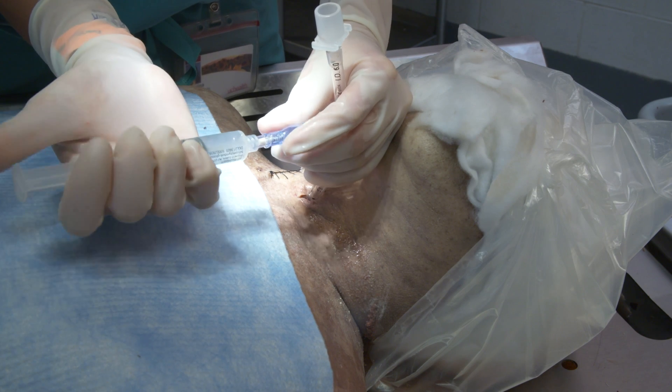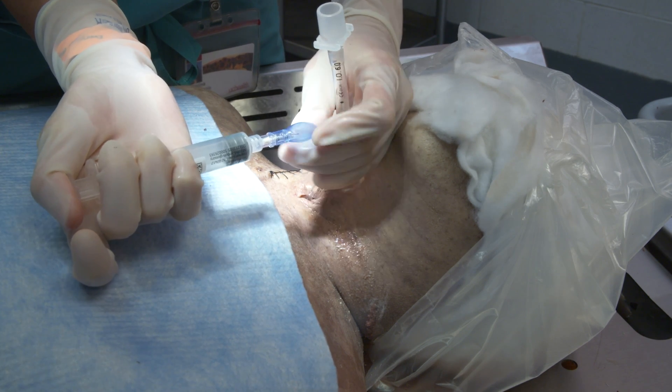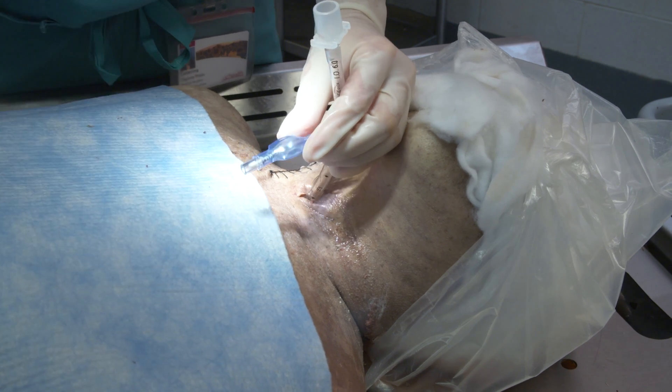Check for proper location by CO2 detection methods, lung auscultation, or bronchoscopy. Secure the tube at the skin entry site with sutures or tape — it is critical that the tube is not dislodged. Once endotracheal placement is confirmed, be sure the patient is sedated, has pain relief, and is restrained, and thus unable to self-extubate. When able, you should also consult a surgeon.